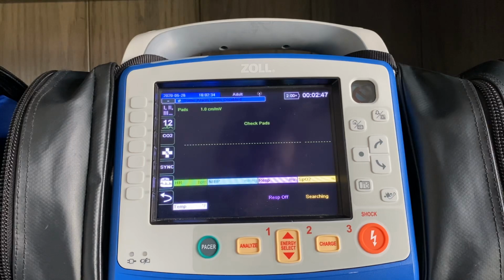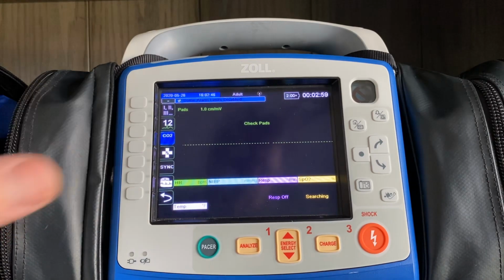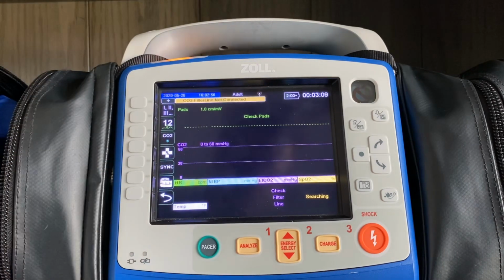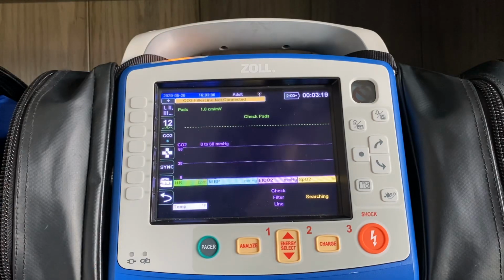Now, in order for the waveform to pull up the fastest way possible, you want to follow these steps. So the third button down on the left-hand side, labeled CO2, when I press that button, the machine beeps at me, the yellow light flashes up here, and you hear the pump start up for a second. What the machine has now just realized is that there's not a disposable piece plugged in, and the message up here, filter line not connected, reminds me to go ahead and plug that disposable piece in.